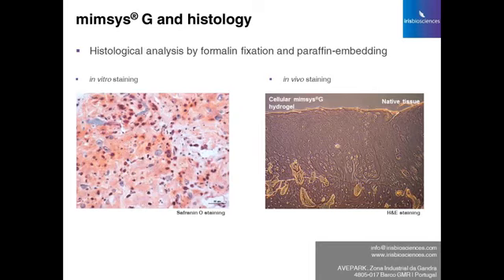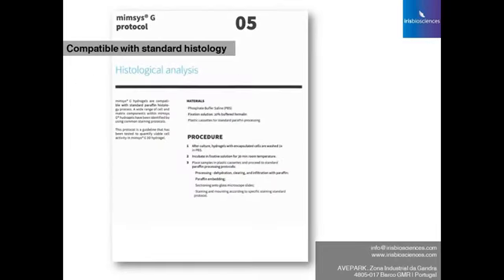Here we have two examples of an in vitro staining of the cells within the hydrogel, or an example of an in vivo sample, where we have mimsys quite nicely integrated with the native tissue. As the last protocol, we prepared a very simple protocol for histological analysis, and stress that mimsys is compatible with standard histology.